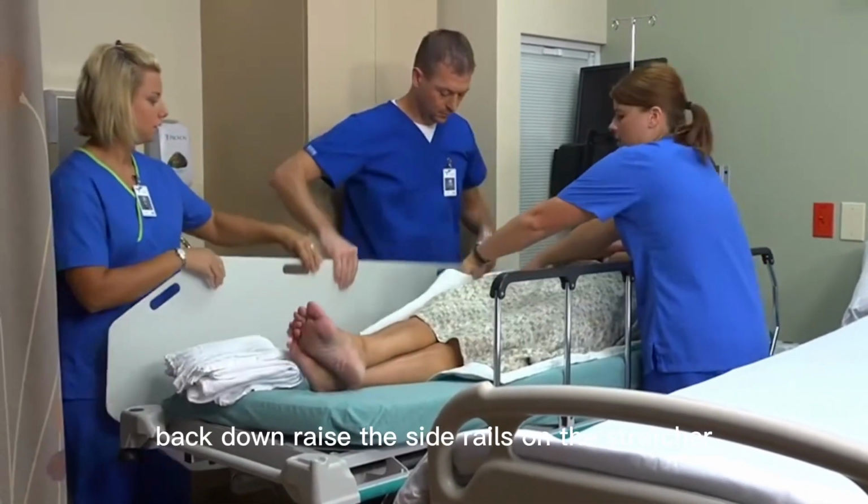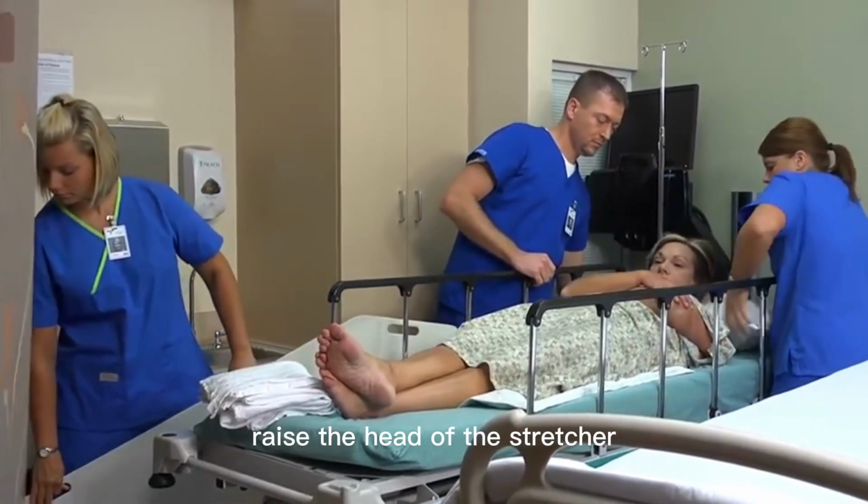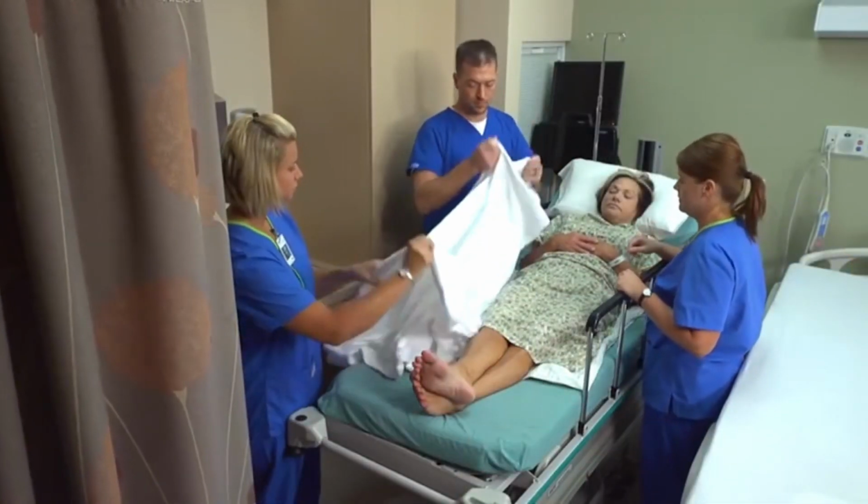Okay, and back down. Raise the side rails on the stretcher. Raise the head of the stretcher if doing so is not contraindicated, and cover the patient with a blanket.